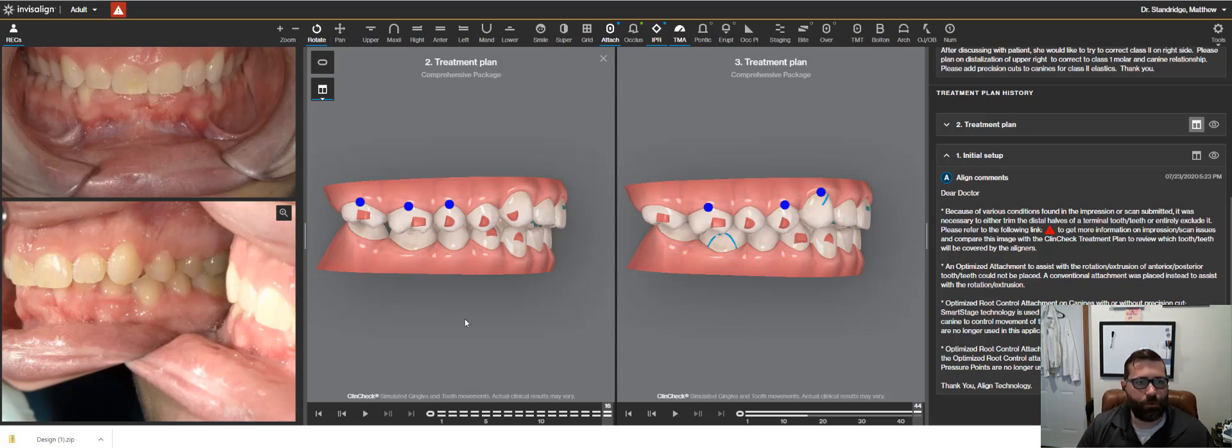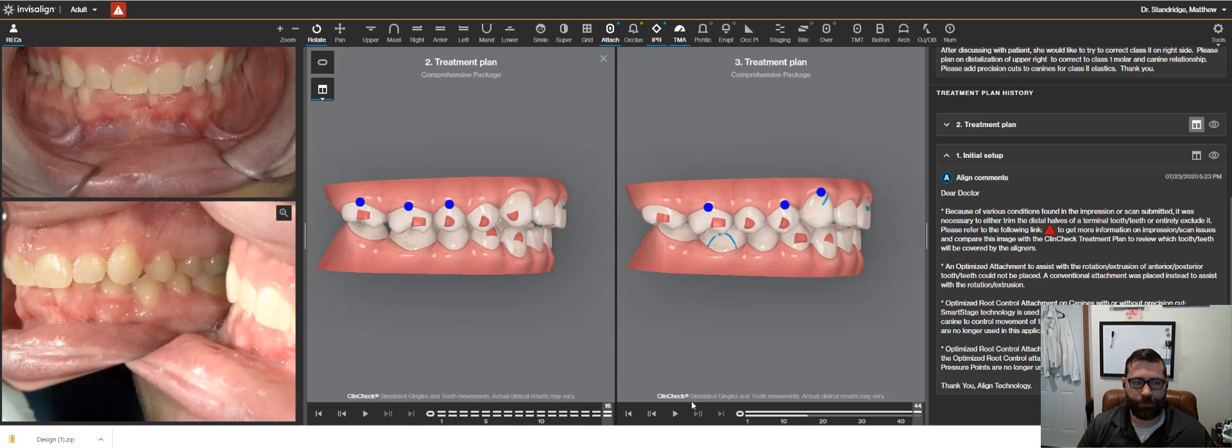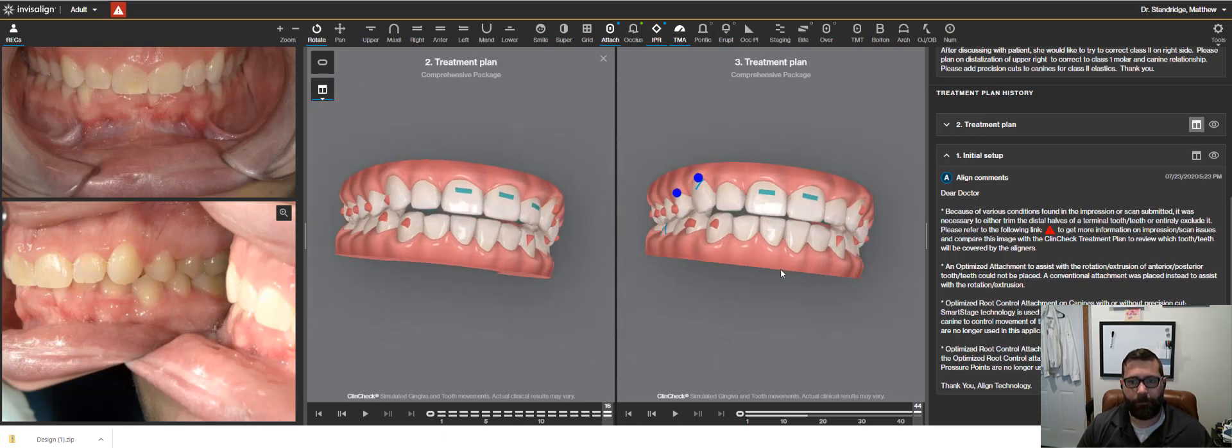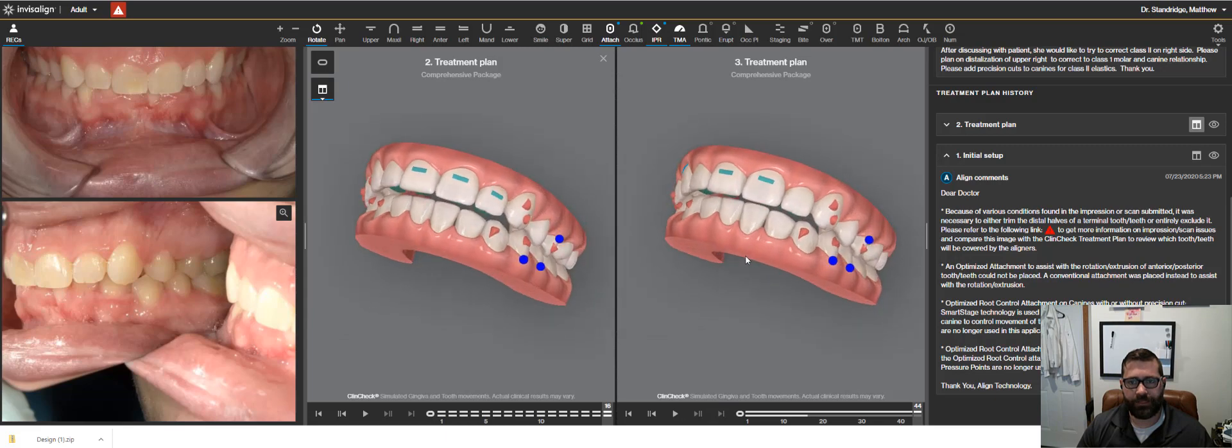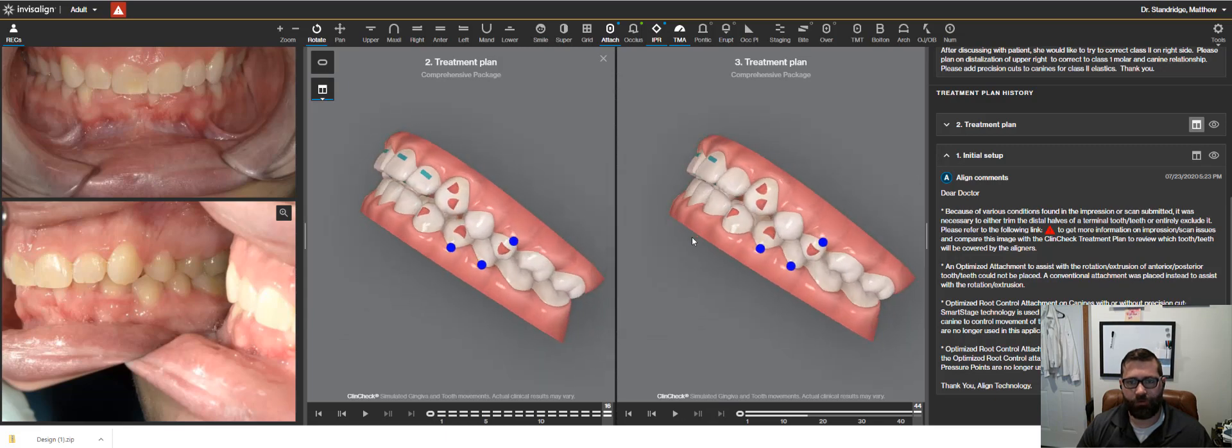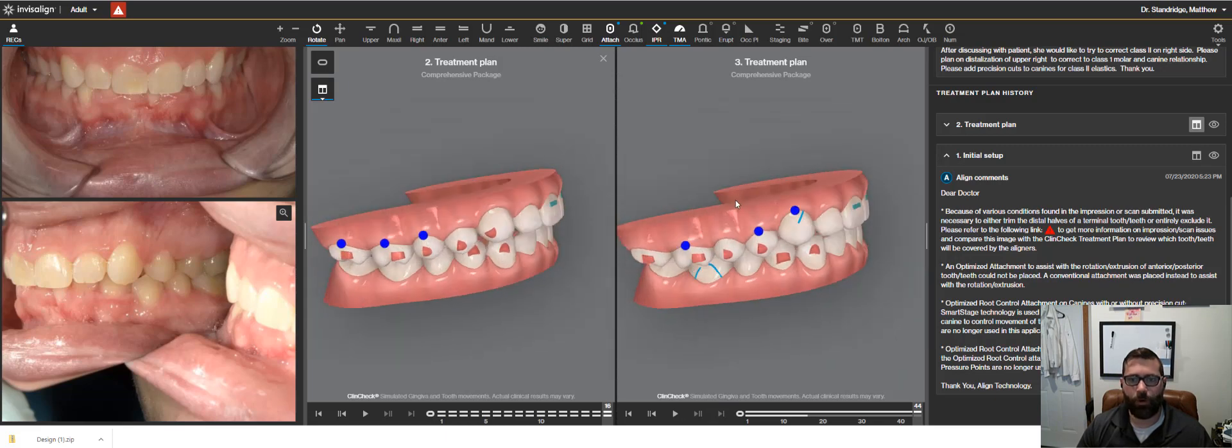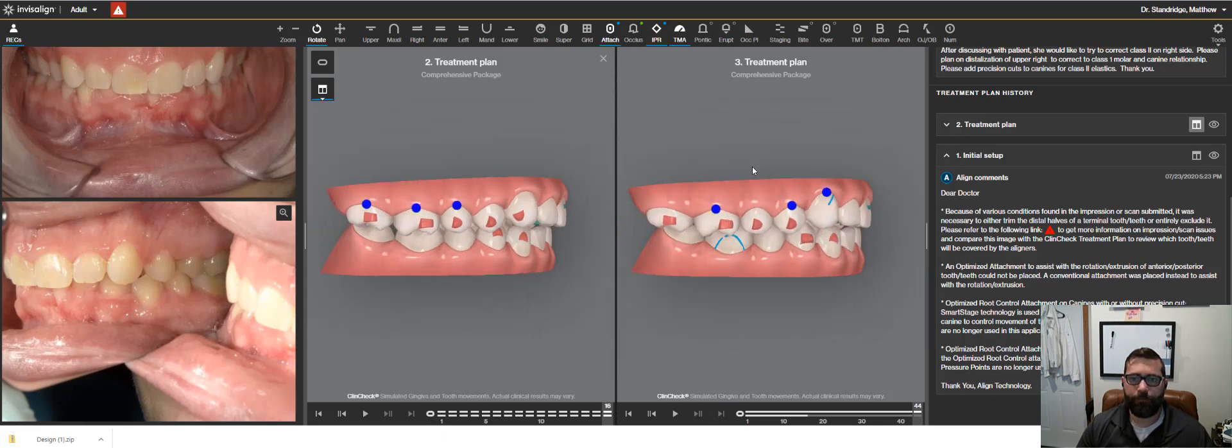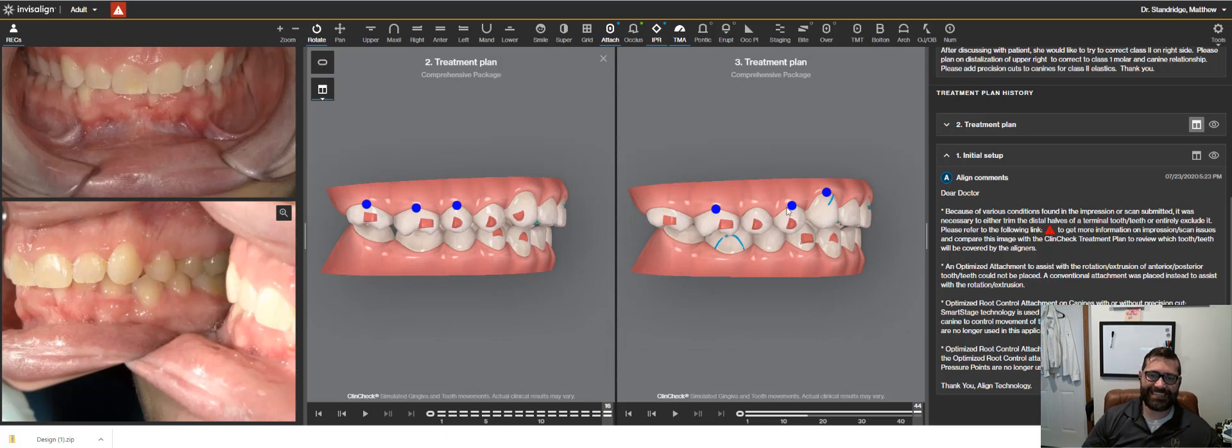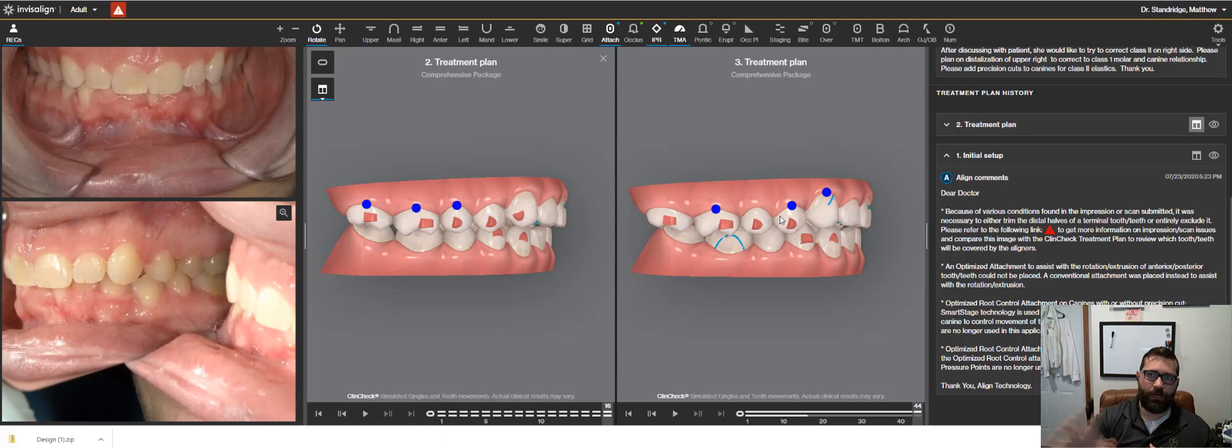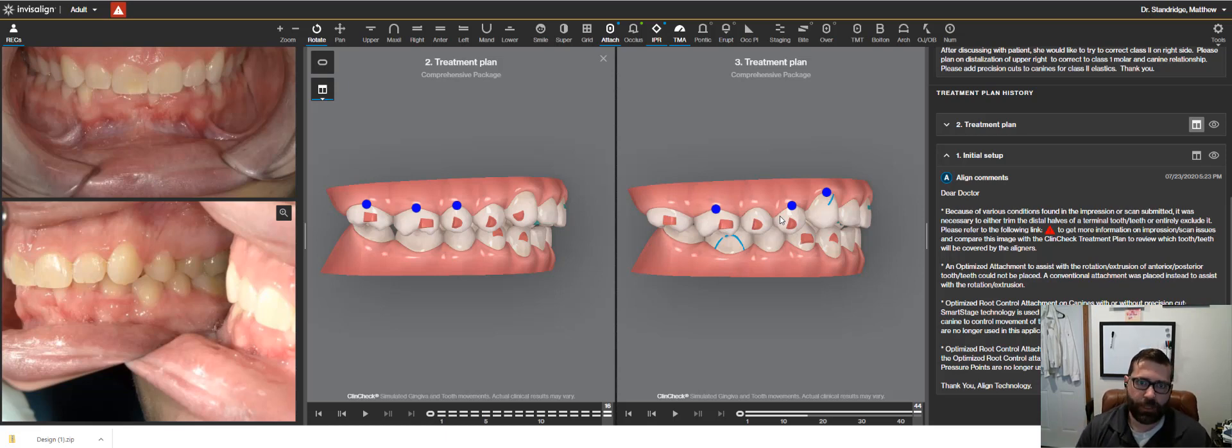So that's what we did. So it went back for a third treatment plan, which you can see here. And so not only are we setting the overbite to zero, but to distalize this side here, we're going through in Invisalign, there is sequential distalization.